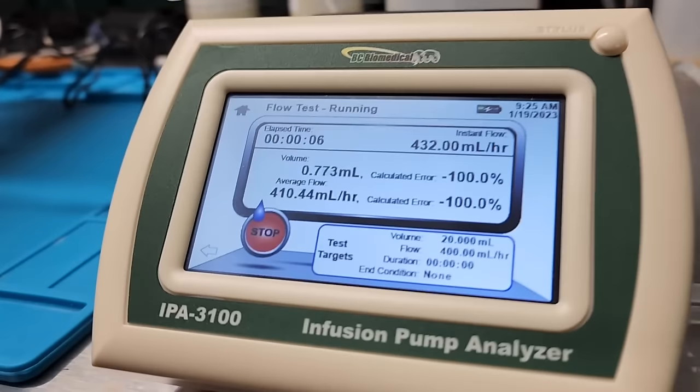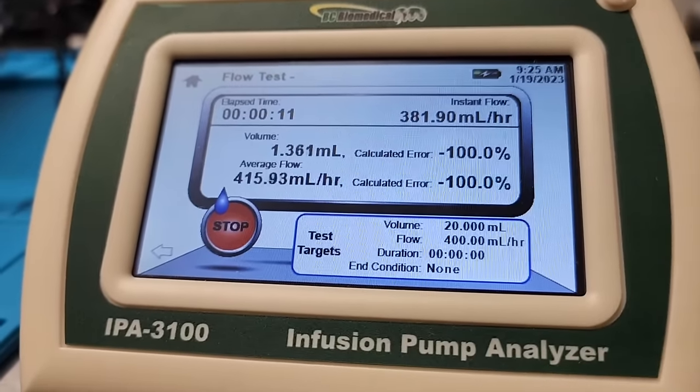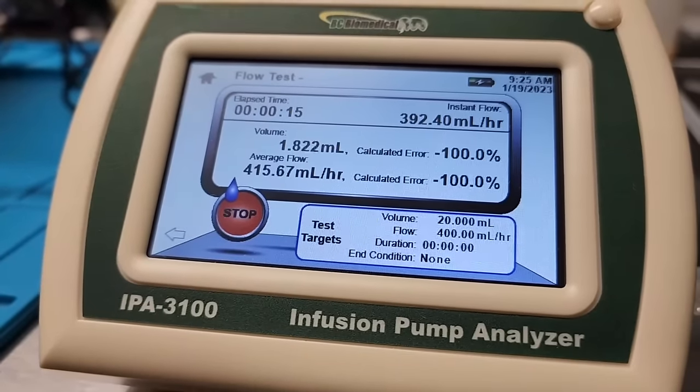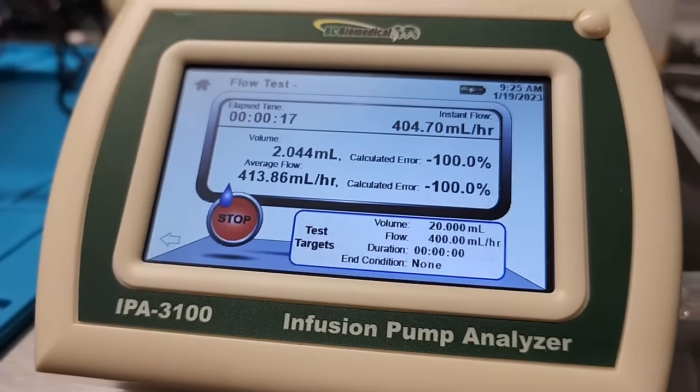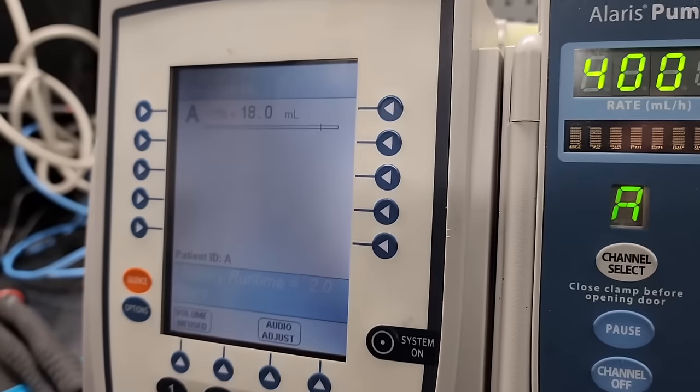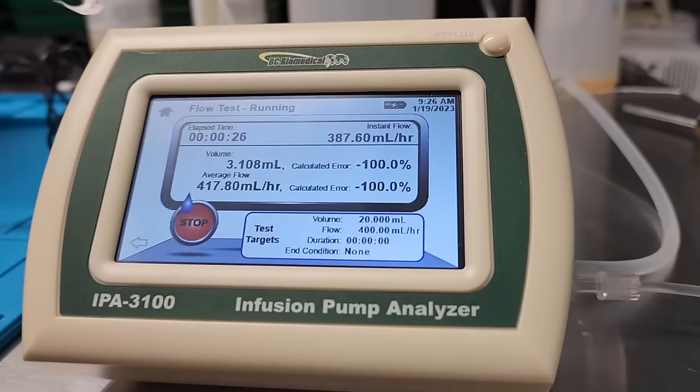So you can see the flow, I've set it at 400 milliliters per hour. Mind you, this pump is not calibrated. So there you go, it's keeping up at 400 milliliters per hour. We've got 2 milliliters already. Yep, 2 milliliters are already infused. It's keeping up quite well.